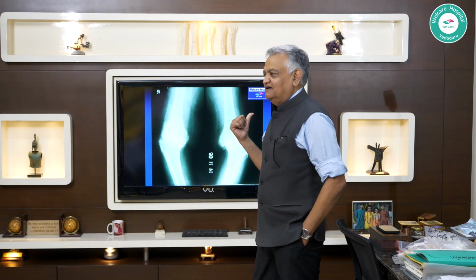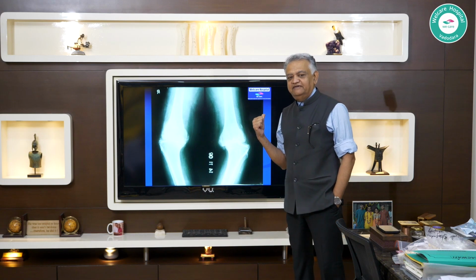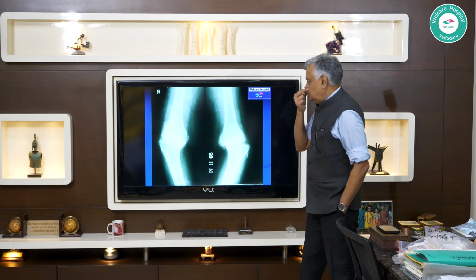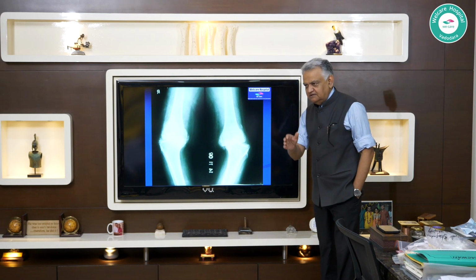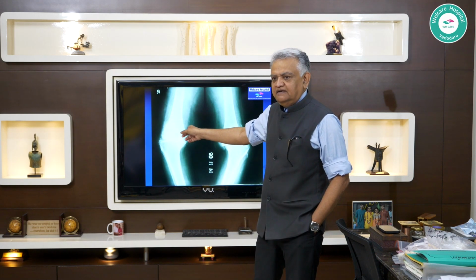So paradoxically, you might find once in a while that your popliteus tendon is a contracted structure, and once in a while you might have to actually release it. That's one part. So at the surgical level, this is very important. Most of the time you will see a shape, and your mind has not processed the implication of what you are seeing. And if you have not processed it, you will do it on the table, groping your way like a blind man in a room. You will eventually find your pathway out, but it will be a slow, laborious, tedious process.